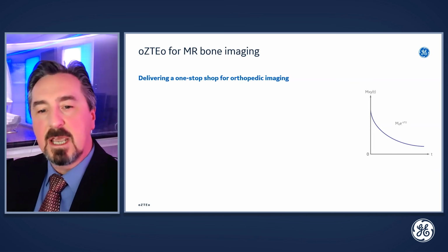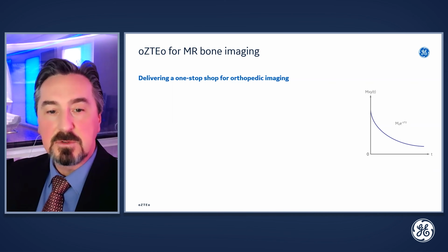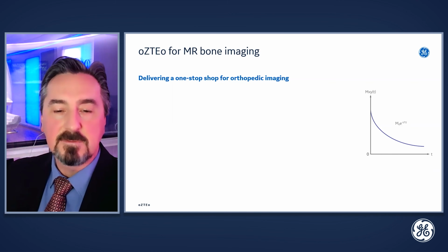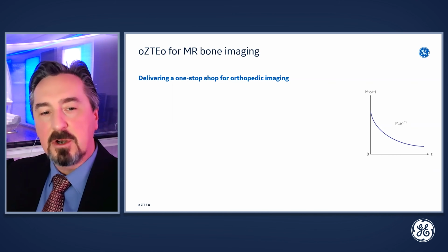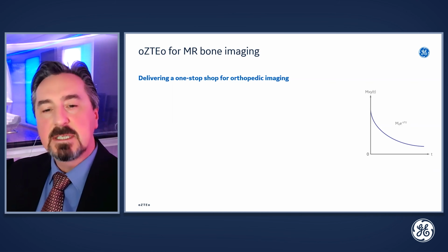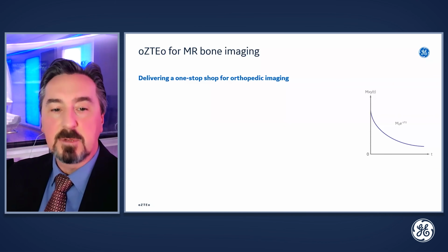Thus far, MR has primarily been a soft tissue imaging modality where tissues such as cortical bone, ligaments, tendons, and calcifications were assessed from the signal void in the image. The reason is these hard tissues usually have extremely short T2s, which means that their signal has decayed by the time of signal detection of conventional MR pulse sequences.